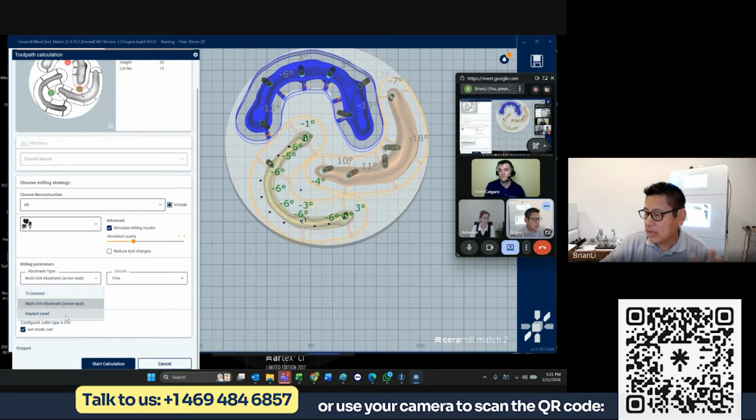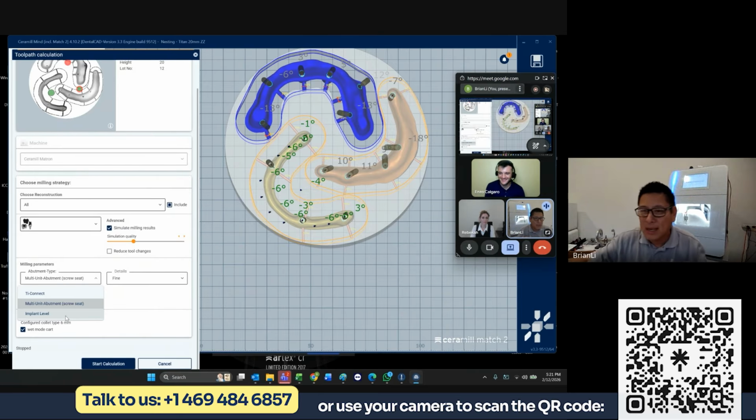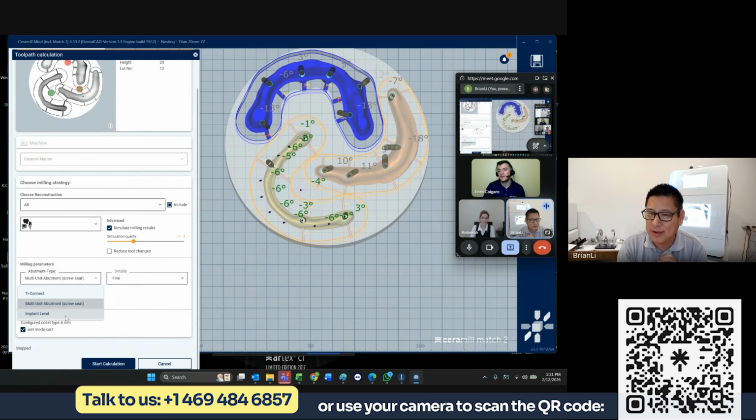Now, we can mill abutments. I've tried them. Pretty fun, pretty cool. Not legal. I didn't sell it, so it's okay. But you have the option to do both, right? And then as a doctor, are you able to do it? Are you allowed to do it as a doctor? I would consult the FDA. Yeah. Perfect. As I understand it, as a doctor, the FDA cannot tell a doctor what to do in his own practice. But if a doctor makes it for another doctor, now you fall under those rules, guidelines.